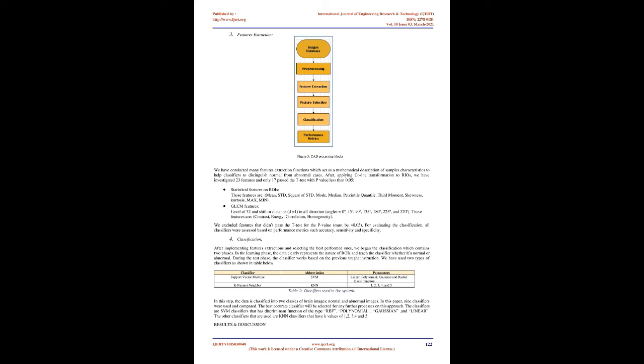Mins et al., in 2017-14, proposed a scheme for classification of brain tumor types from MR images. Threshold-based image segmentation was performed along with processing like RGB to gray color space conversion and filtering for noise removal. Then GLCM-based textural features were extracted from the segmented images. An adaptive boosting technique called AdaBoost outperformed the neural network with 89.90% accuracy.